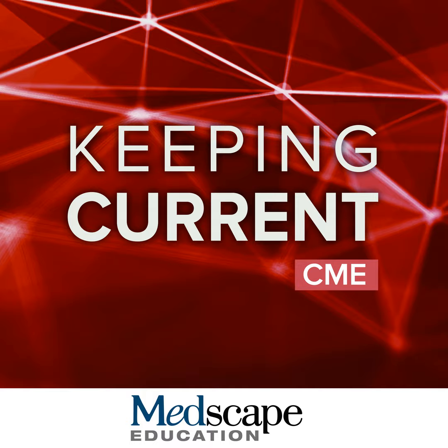LR4, on the other hand, are more serious lesions with a higher risk of malignancy, around, I would say, 60%. So that's also risky, but just remember that about 40% of them are non-malignant. And those can be more suspicious than LR3. They may exhibit arterial phase hyperenhancement, portovenous or transitional phase washout, and hypointensity, but cannot be classified as LIRADS 5 because they don't have the whole spectrum of findings. So I'm going to show you a few cases exemplifying the findings.